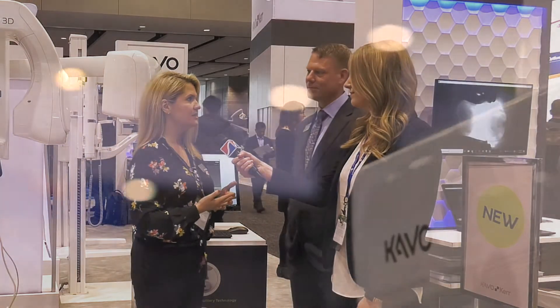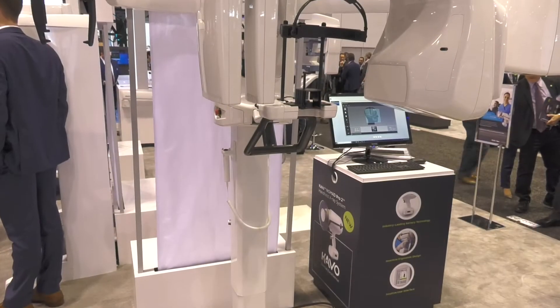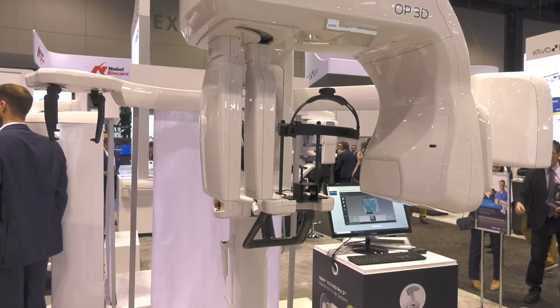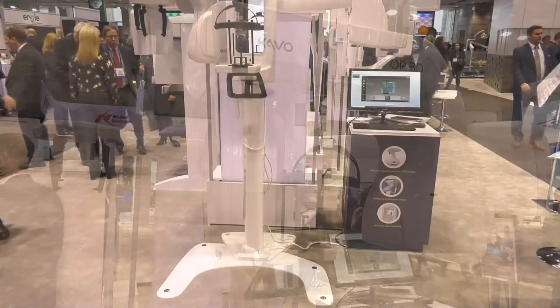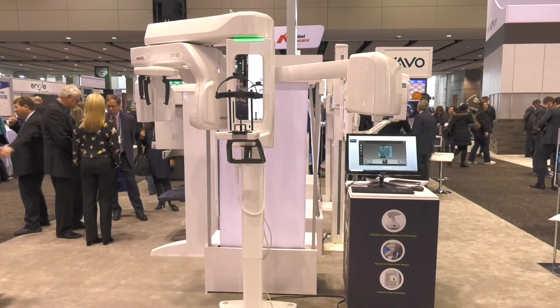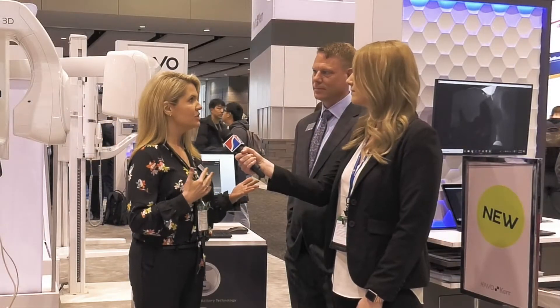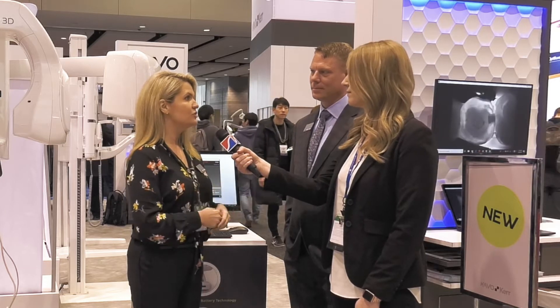So we just added the Cephalometric option to it, which really rounds out this platform to have a pan, 3D, and Ceph offering. The uniqueness of it is that it offers two tube heads. The concept behind it is we don't have to sacrifice the geometry of the image, and we get a dynamite image out of it. So the big feature is the two tube heads.